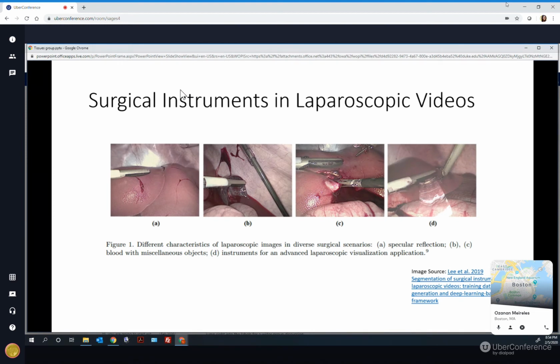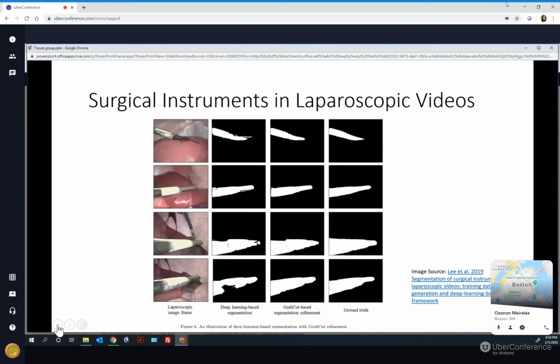And what Pat said on this slide, I think, was the one just after Rachel talks about it: you see a structure that looks like a vein going under a structure that looks like an intestine with the background of fats. Then you just say this is the inferior mesenteric vein.